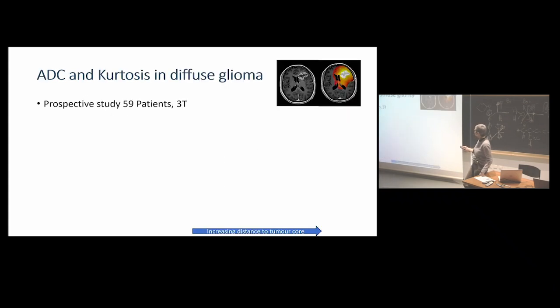And what they did then is that they did MRI. So this is a T1 weighted MRI, and they have actually given a contrast agent to this patient. By giving that contrast agent, wherever the blood-brain barrier is ruptured, the contrast agent can go inside the brain and shorten the T1.